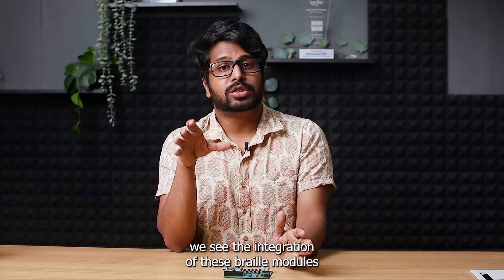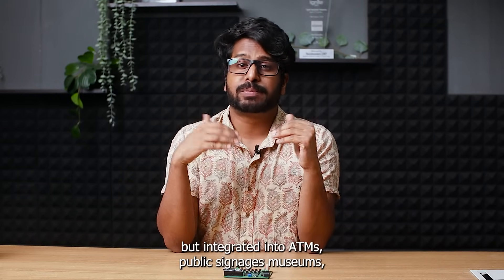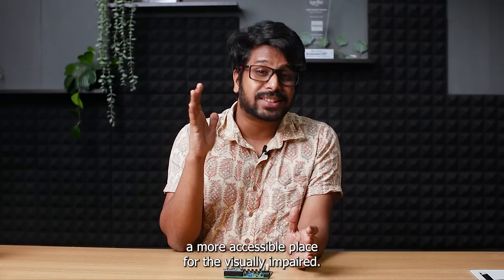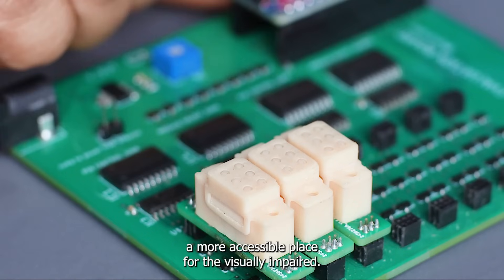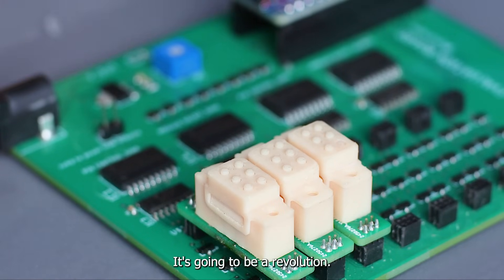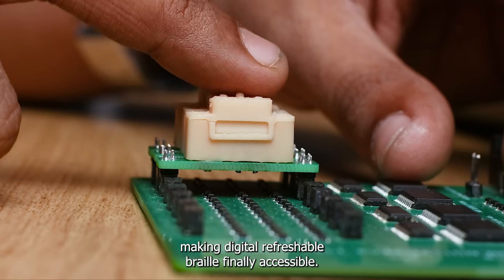We see the integration of these braille modules in more than just refreshable braille displays — but integrated into ATMs, public signages, museums and much more to make the world a more accessible place for the visually impaired. The electromechanical refreshable braille module is not just a device; it's going to be a revolution, making digital refreshable braille finally accessible.